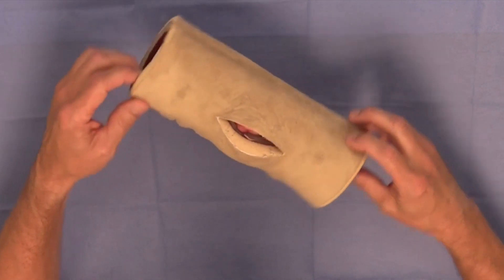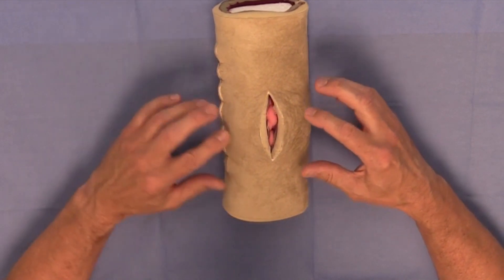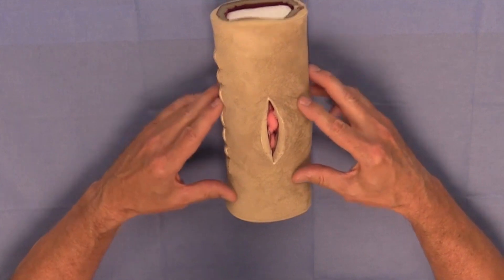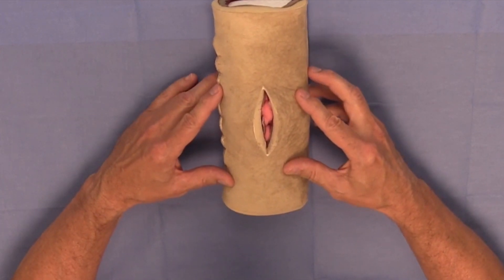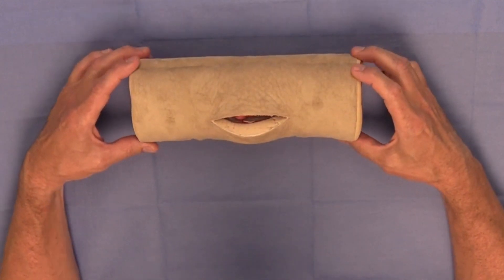So you're standing at the end of the limb, and so it's fair game really to use the DAISY either in this direction as it is demonstrated here, or 90 degrees to that as is demonstrated here.